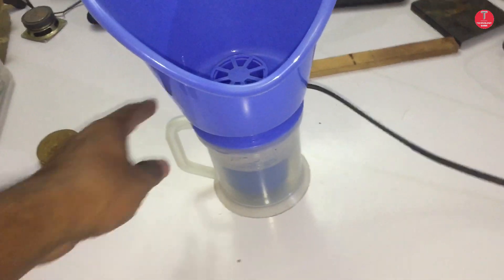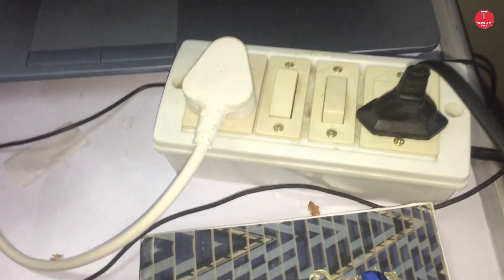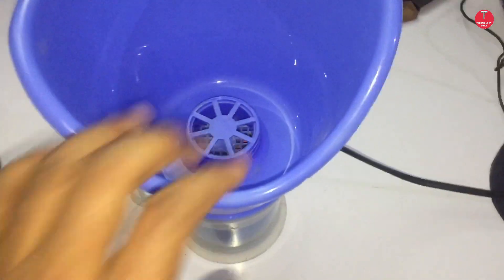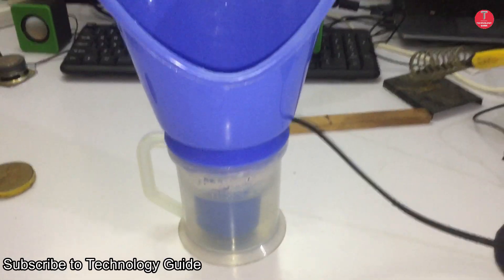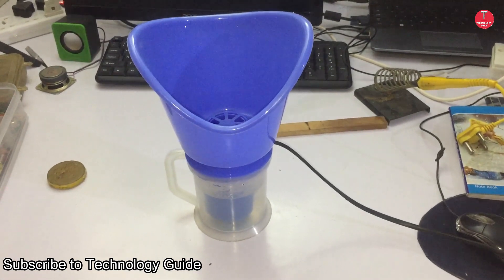Hi everyone, welcome to Technology Guide. In this video I am going to explain how to repair a steam vaporizer. Many vaporizers stop working after a few months of use.